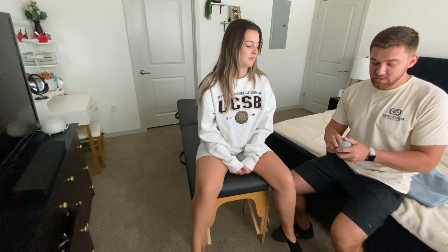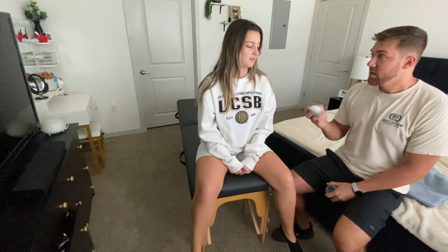What I want to take you through today is called an ice massage. I have this little device here that has a sphere of ice. I'm just going to give you a gentle massage on the affected area.